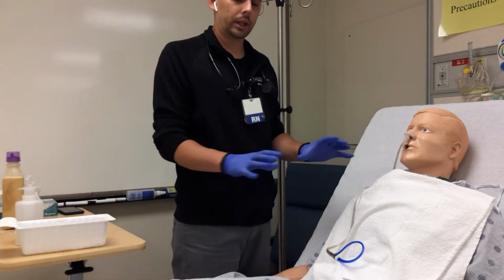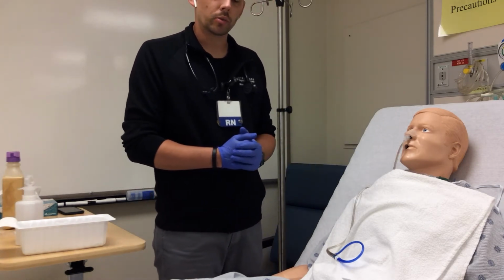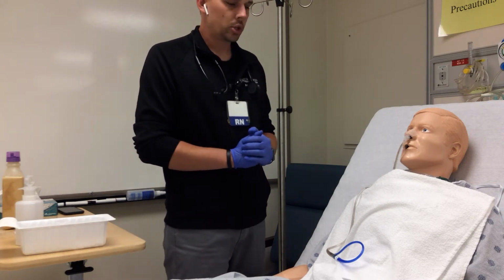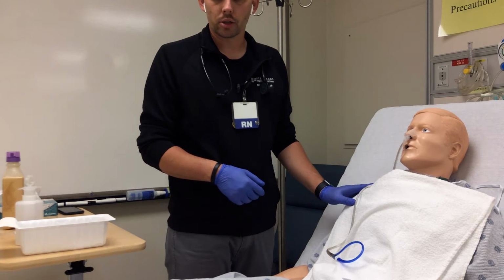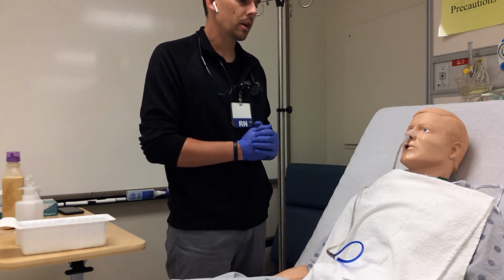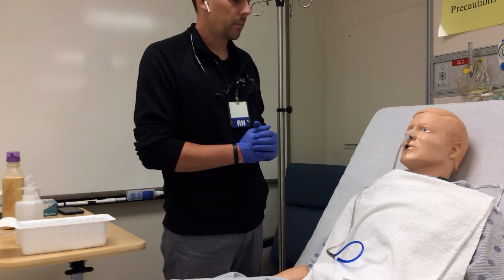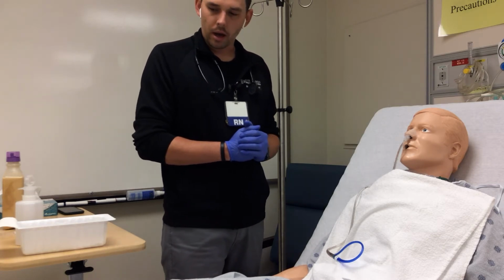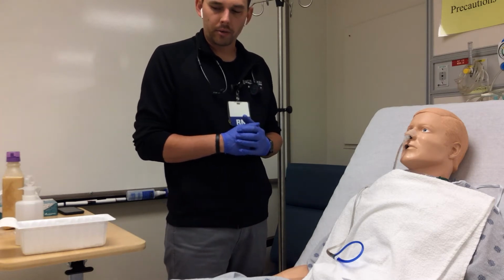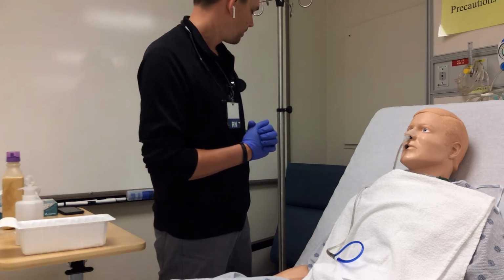So again, making sure we've completed our full GI assessment, our full NG tube assessment prior to doing any of this. Explaining the procedure to our patient, making sure we have a towel here again just to keep them clean. Making sure our head of the bed is at least 30 degrees, preferably 45, but at minimum 30 degrees. We have checked our labs, monitored our weight, everything we need to do beforehand.